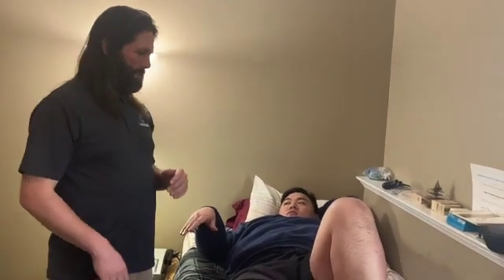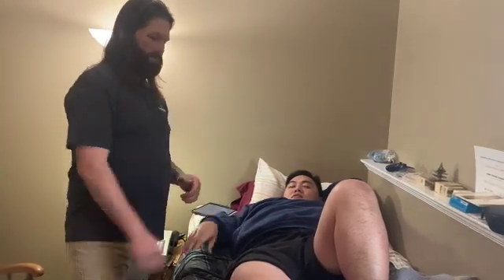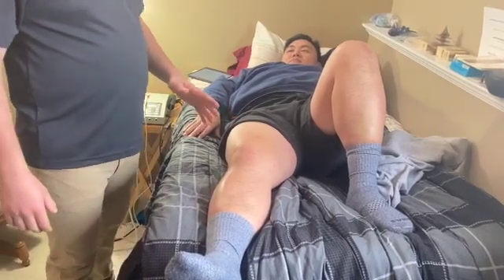All right. My name is Hank Guzman. I'm a student physical therapist. And today we have Kevin in the clinic. He's got some osteoarthritis in his right knee. So we're going to use the electrical stimulation machine. We're going to do some high frequency TENS on it.